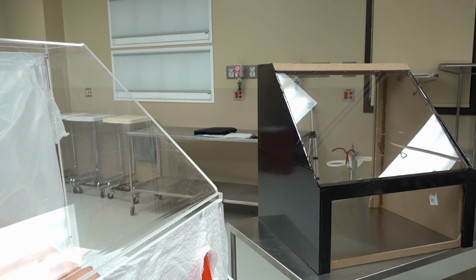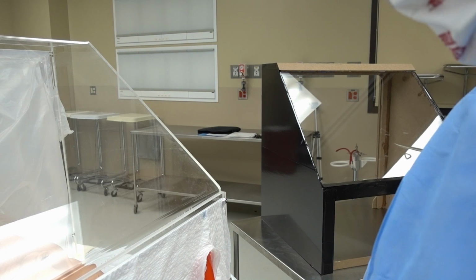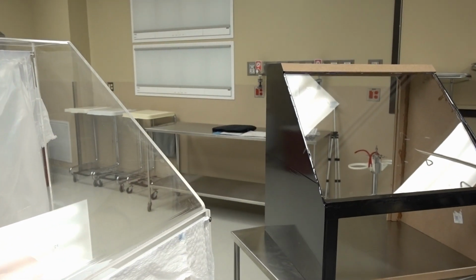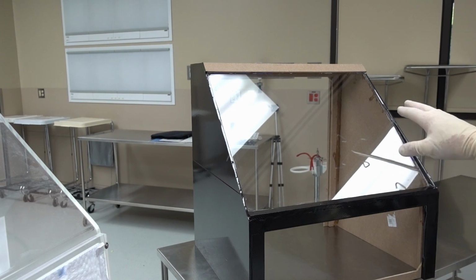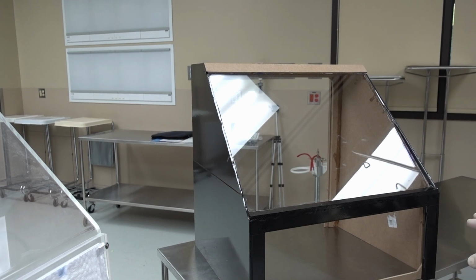And this is only the second box. Actually, this is the first acrylic box. I built this one at home and could get no plastic in Tulsa. It's all being used to protect people at the cash registers. So the only piece of plastic I could get in 1/4 inch was that one. So I just bought some fiberboard and built the rest of it. But it's got a simpler design for the rails. It works, but you have to put the box up.